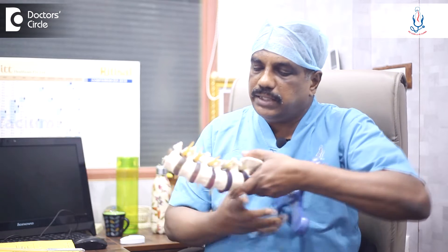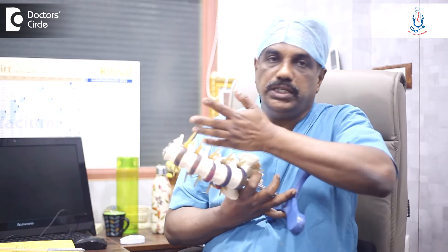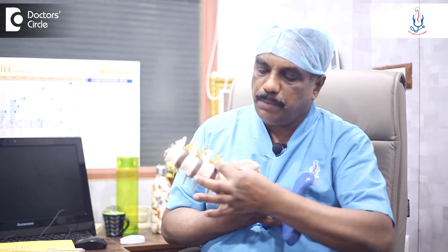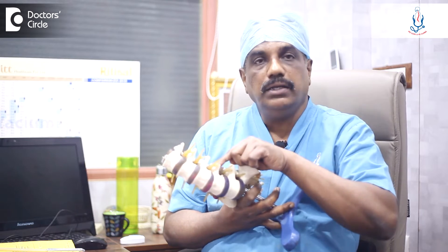In Spinal Fusion Surgery, initially what we do is we put screws in the pedicles. Pedicles are the bones which connect the posterior or back elements with the front body. These are the pedicles, and through that we put screws.